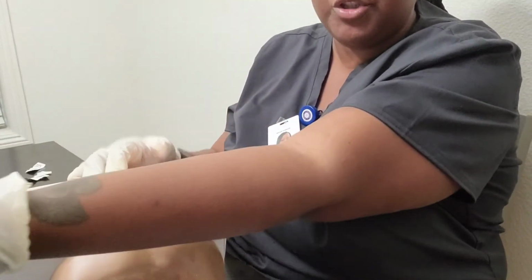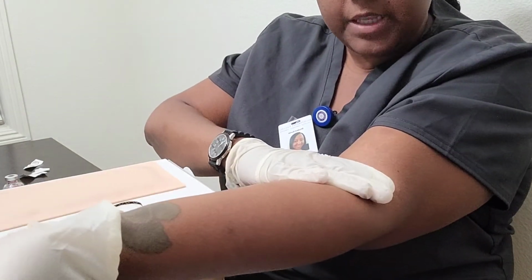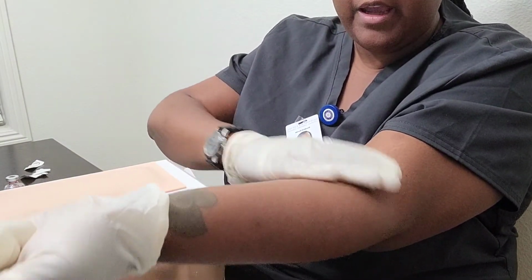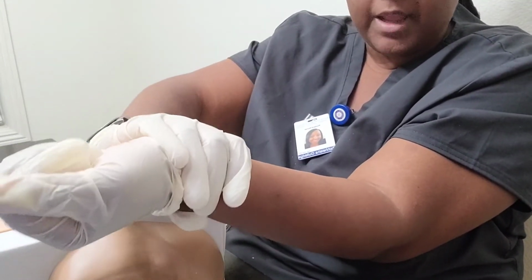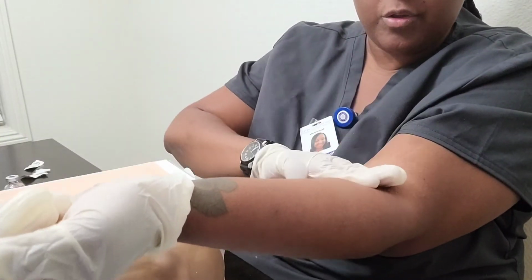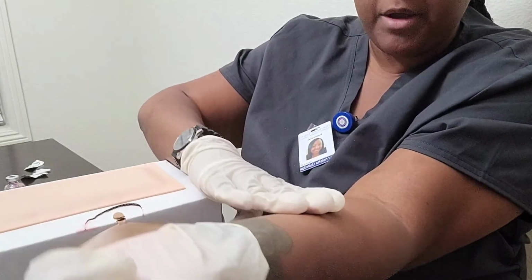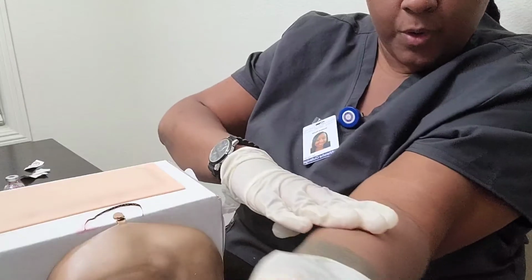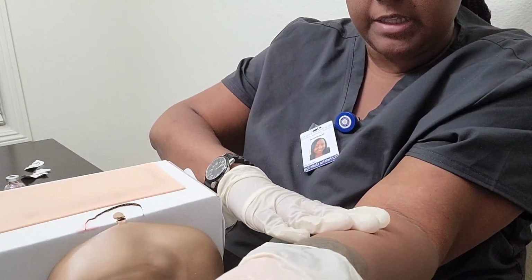Okay, so for the area, I will do 3 to 4 fingers in this area, and then the hand right here at the wrist. So 3 to 4 fingers, and then the hand. So right about here is where I will administer the injection for the TB skin test.